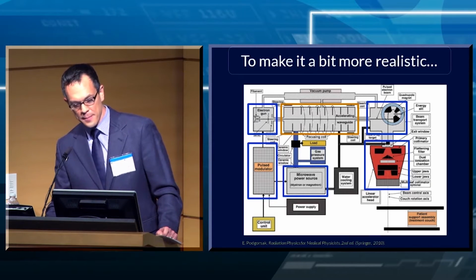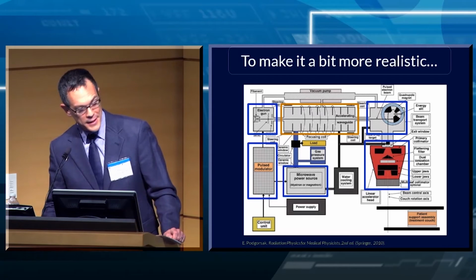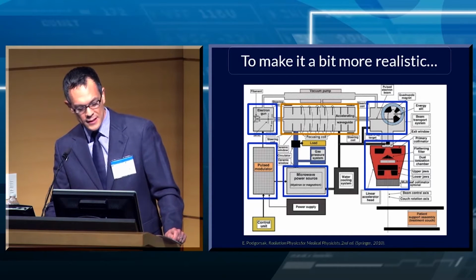Then they go around a magnet to bend them towards the patient. And then they go through the treatment head of the linear accelerator. And I'll describe that in a minute. And then they get to the patient.